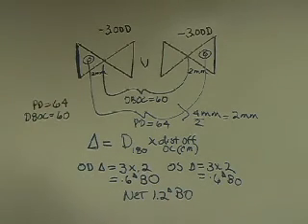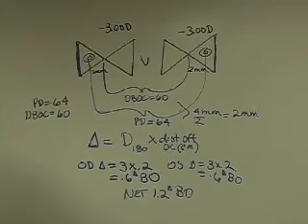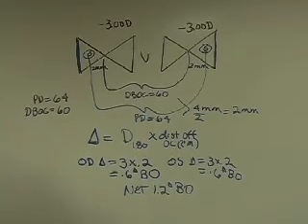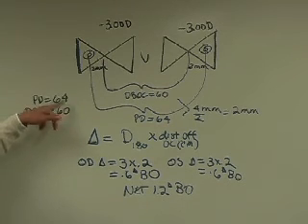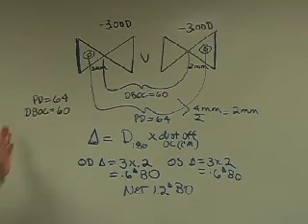And you will find that that is over and above the 2/3 of a prism diopter that's allowed with the ANSI standards. So in this case, the 4 millimeters that the patient's looking off in both lenses ends up inducing more prism than is tolerable, and that could be sent back and had the job remade at the laboratory.